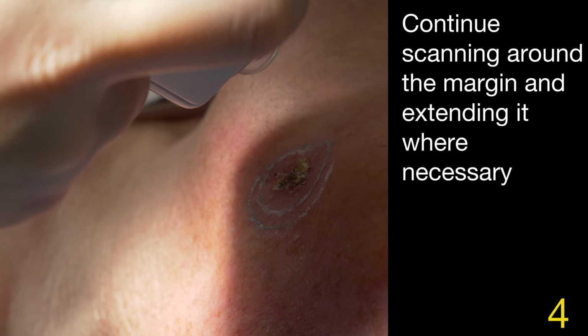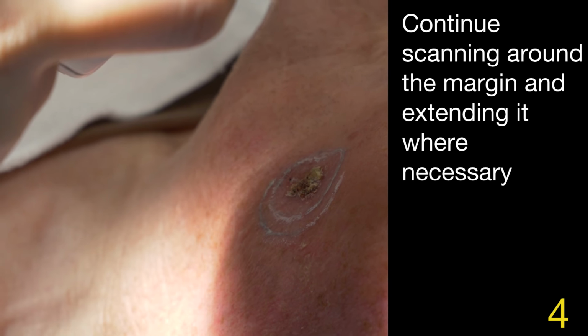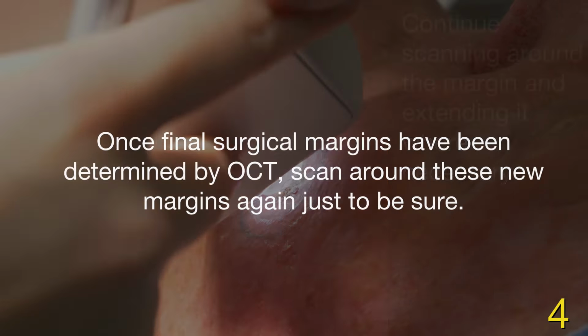So the technique is really to, instead of sliding it over the skin, you pick it up and place it back down on the skin, but overlapping. Yes, by overlapping.